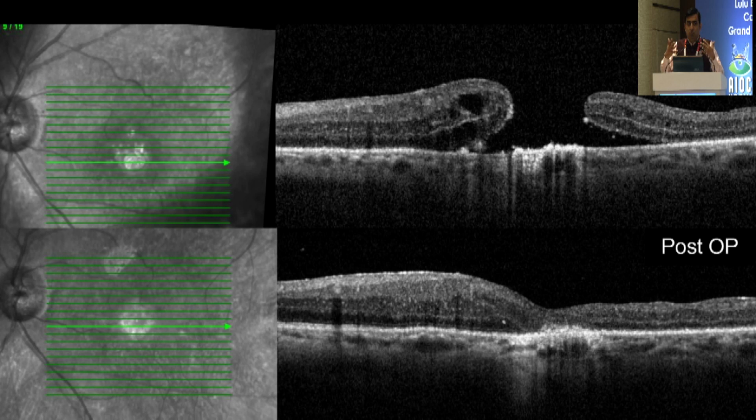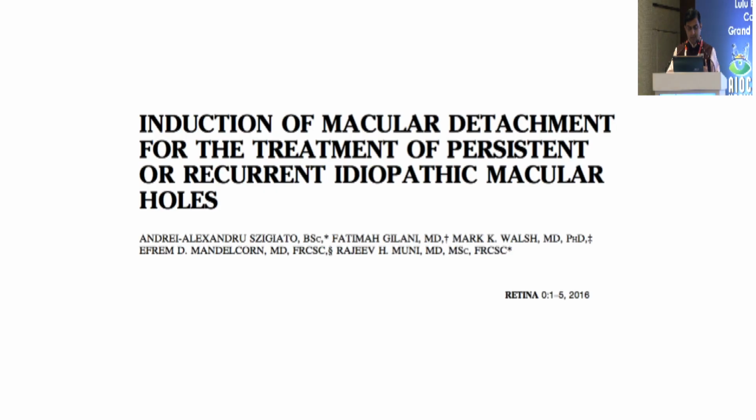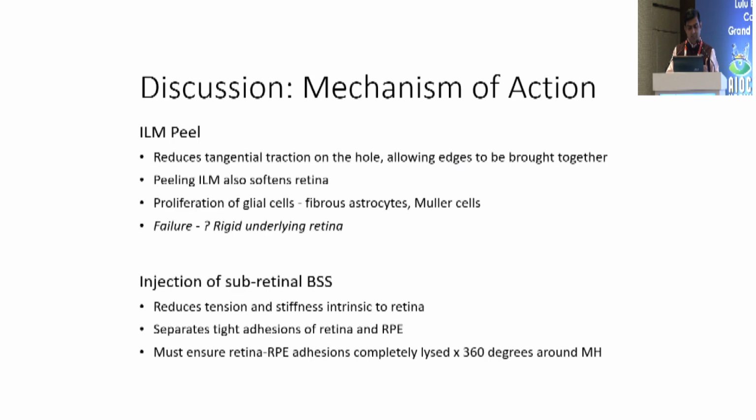So if you don't want to go more aggressively like neurosensory graft techniques, I think this can be tried. This is another very good technique. So this was the macular detachment induction.